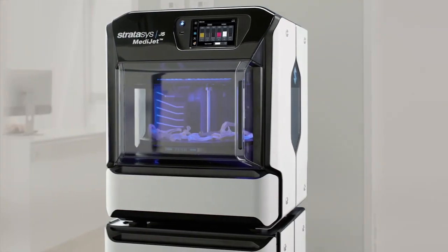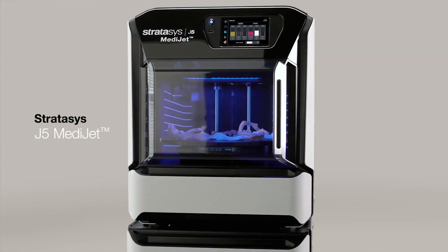The J5 MediJet all-in-one medical printer. The new standard for medical printing.